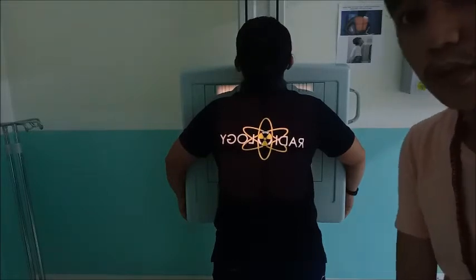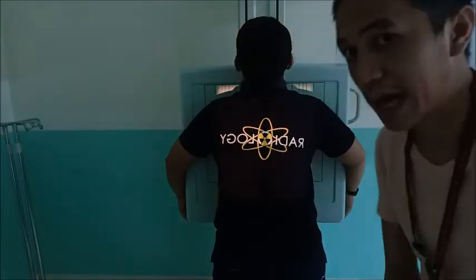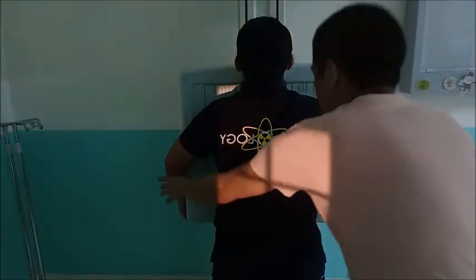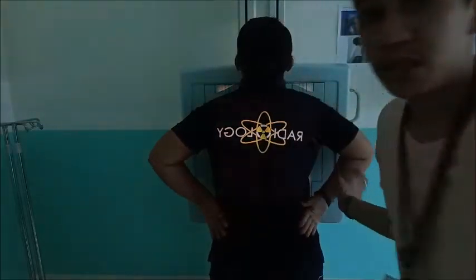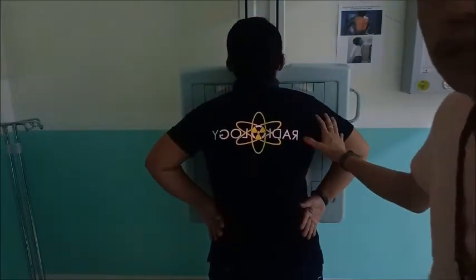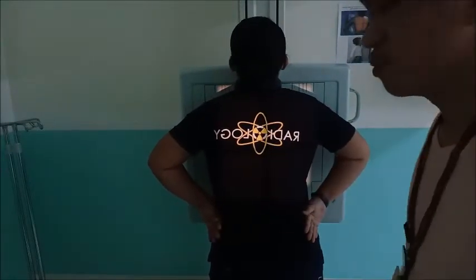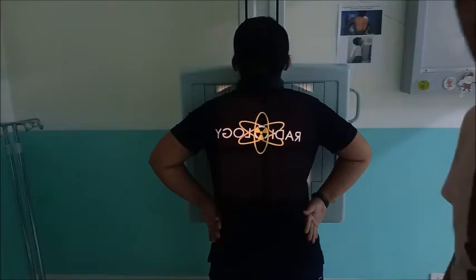So make sure that you know the condition of your patient. So you have to ask the patient if malipong ba siya. Okay, if ipahinganan mo si patient, tapos madugay pa kag-ayo, so paingani ka dugay, kakabantay na matumbang mo ang patient.